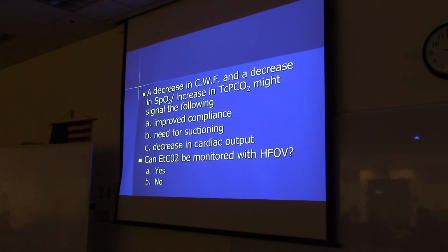A decrease in chest wiggle factor and a decrease in SpO2, an increase in the TCPCO2 might signal the following. A, improved compliance. B, a need for suctioning. Or C, a decrease in cardiac output. B. B, a need for suctioning. Very good.